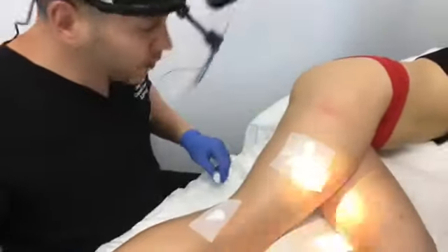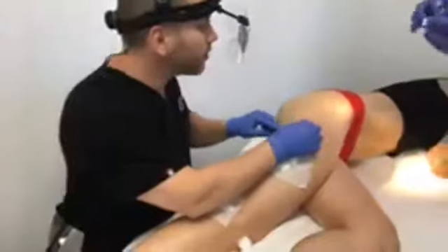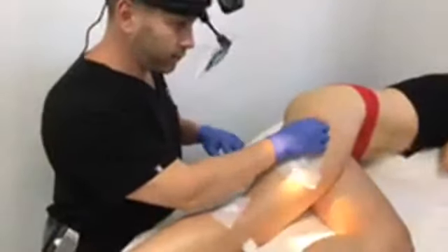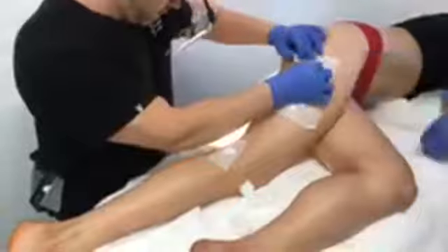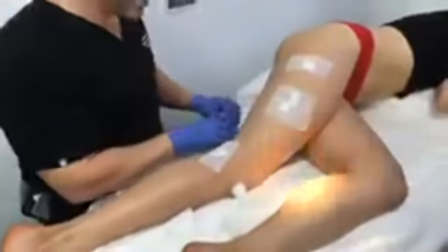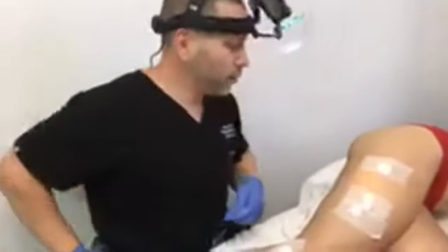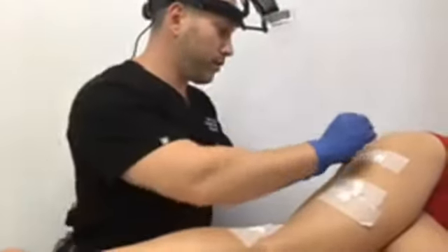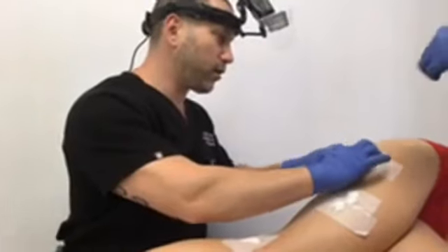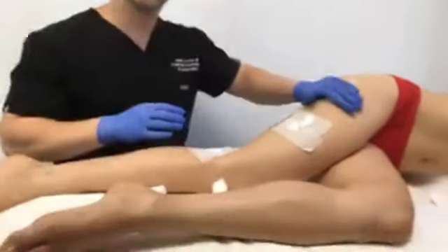Okay, so let's put that in here. Take that away. Need that tape right here. The most important thing now is to keep it compressed. So that's sclerotherapy for leg veins, and she'll need multiple treatments over time, but tonight for 24 hours, she's going to keep this pressure on here, then she'll wear a Spanx or a compression on top for the next week or two. That's it.